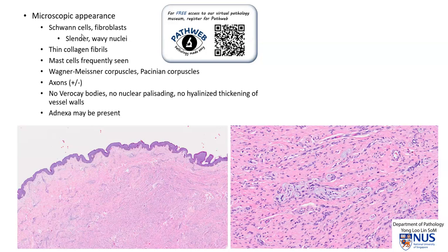Microscopically, neurofibromas are composed of Schwann cells as well as fibroblasts, and these are cells with slender, wavy nuclei. There are pink collagen fibrils in between the nuclei. Mast cells are frequently seen, as demonstrated earlier. Sometimes also Wagner-Meissner corpuscles as well as Pacinian corpuscles can be seen, and axons may be seen running through, especially highlighted by special stains.